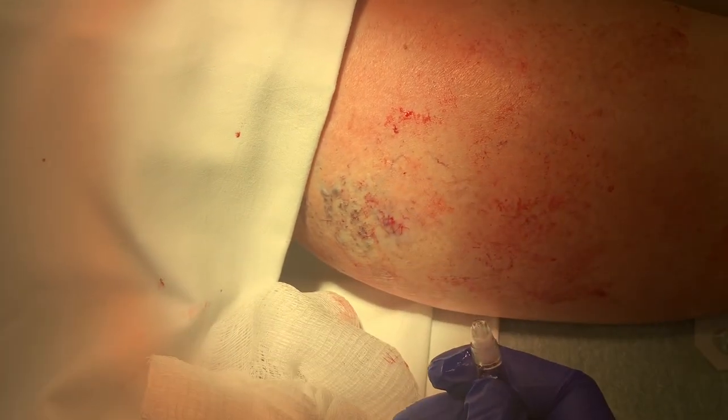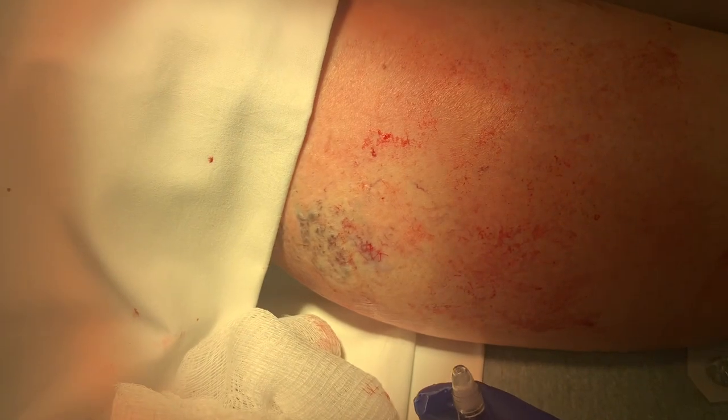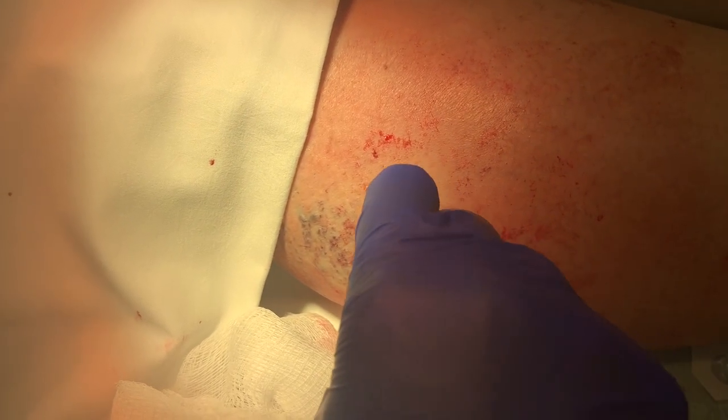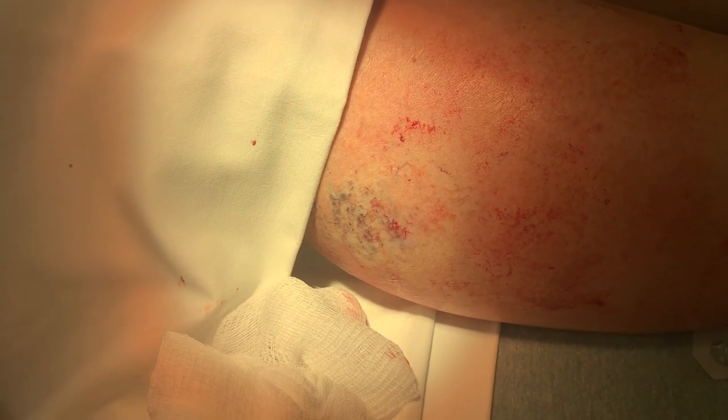Once the glue is dry, we're going to put a new dressing on it and use a bandage to wrap it up tight. Have her elevate it and follow up as needed. These sutures will just dissolve on their own. And that's how you fix a varicose vein.